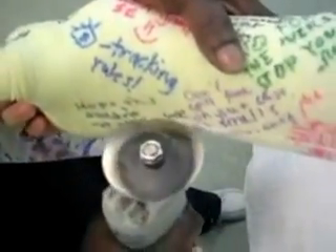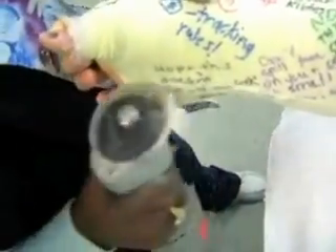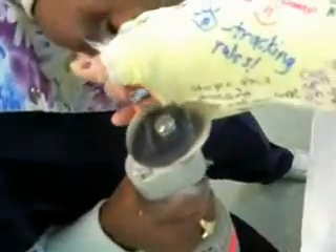Are you okay? Yeah, I'm fine. I felt that. That's okay. Some of the cast is sick and some is thin. Yeah, it's hard for me to tell what this is right here.